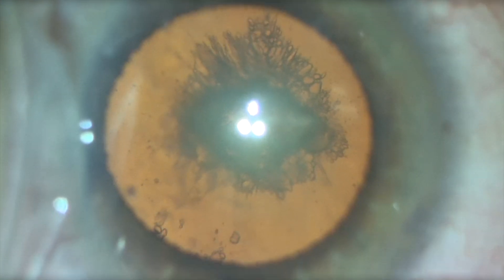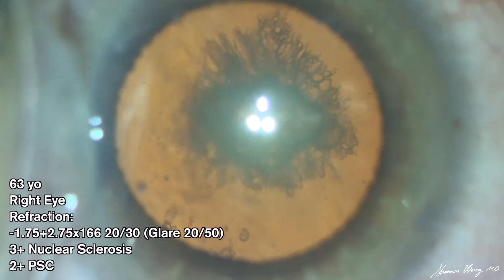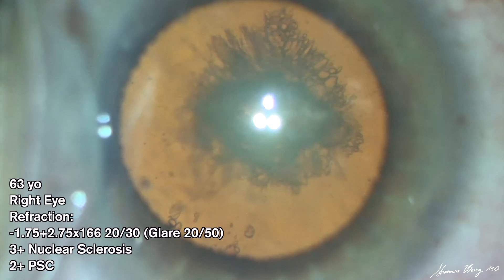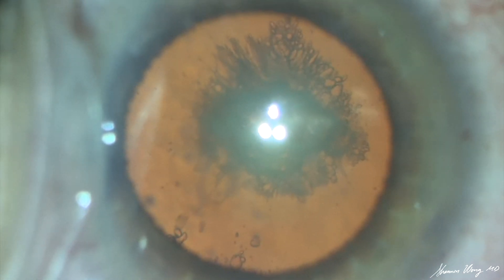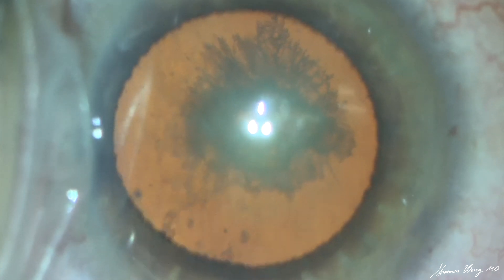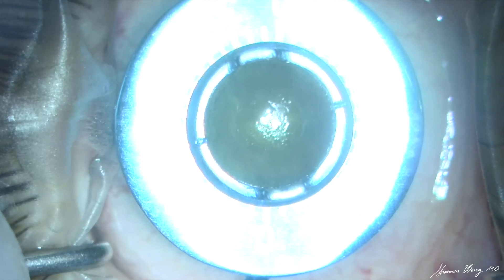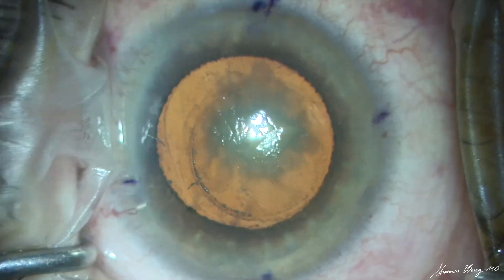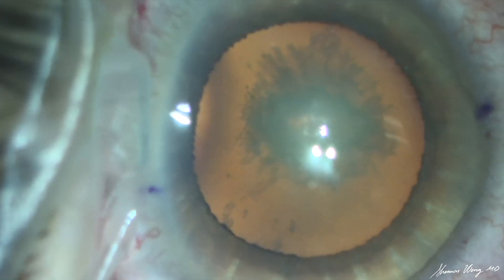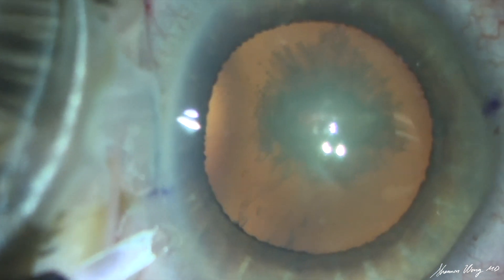Here we are about to begin cataract surgery on a 63-year-old patient. Upon initial inspection of the lens through the microscope, we noticed that the lens shakes and oscillates in an unusual manner, indicating phacodenesis and likely loose zonules. I calmly tell the team in the operating room to stand by and get some additional equipment.